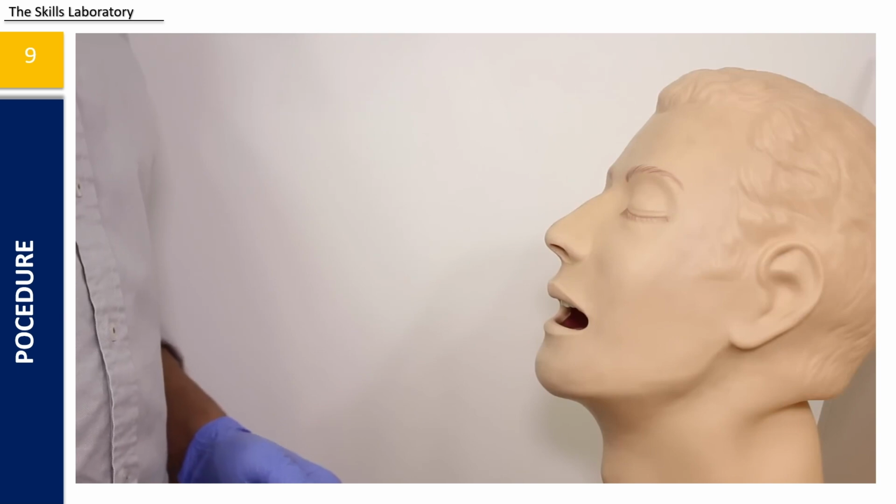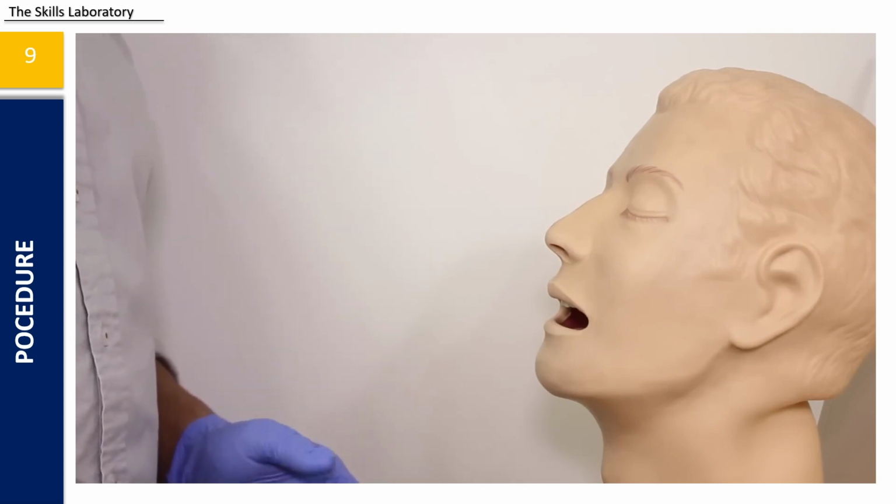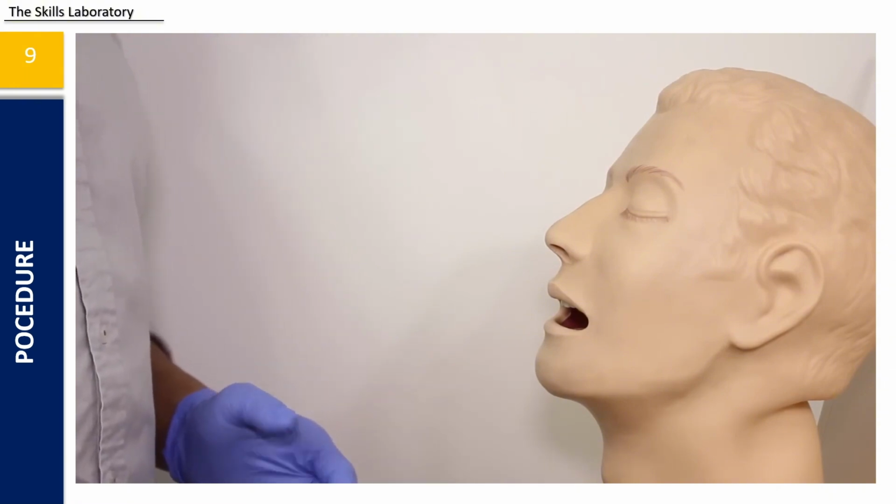I'm going to put the tube in now. It is sterile. It's going to be a bit uncomfortable. If you could take small sips of water while I'm advancing the tube and tap me on the arm if it gets too uncomfortable.